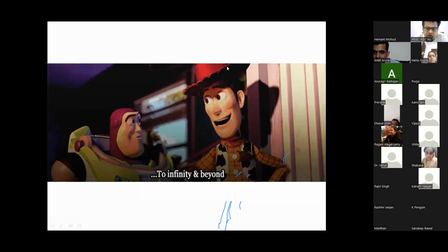Okay. Please repeat. He means to say, the burr for extraction. Okay. So the burr, you can write it down, is the carbide burr, and basically the burrs that are used are 703 and 702. Okay, 703 and 702 burr, with a straight hand piece.